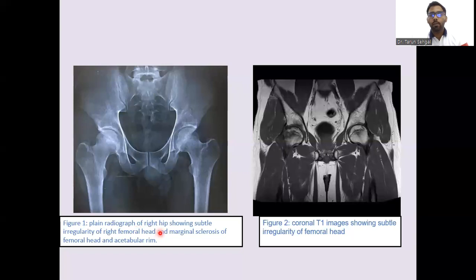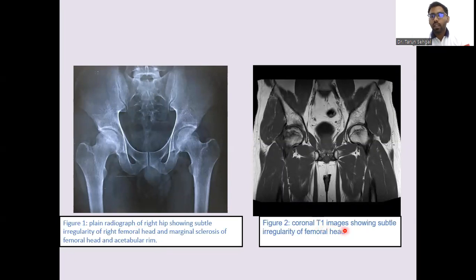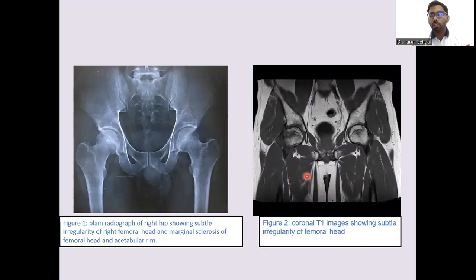Plain radiograph of the right hip showing subtle irregularities: we can see irregularities of the right femoral head and marginal sclerosis of the femoral head and the acetabular rim. On the same day, MRI was done — this is the coronal T2-weighted section of the MRI hip joint, which shows subtle irregularities of the femoral head.